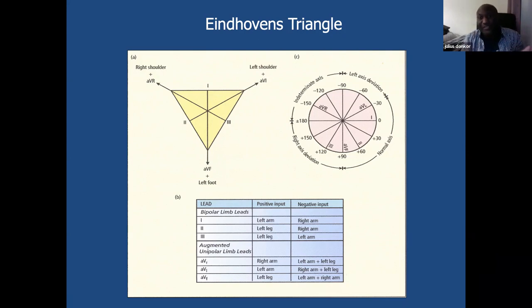Sometimes you might even use this when somebody has heart failure, by changing the LV-RV pacing offset. You keep changing it, minus 5 milliseconds, minus 10 milliseconds, minus 20 milliseconds, and see how the QRS narrows or changes into right bundle branch in V1, and lead one becomes more right axis, like more negative. So some people say some patients can respond better with this. Some doctors think it's completely rubbish.